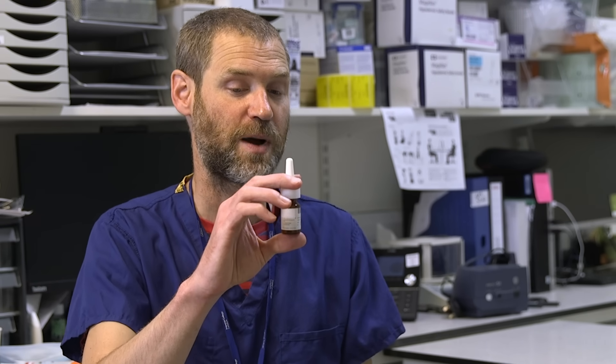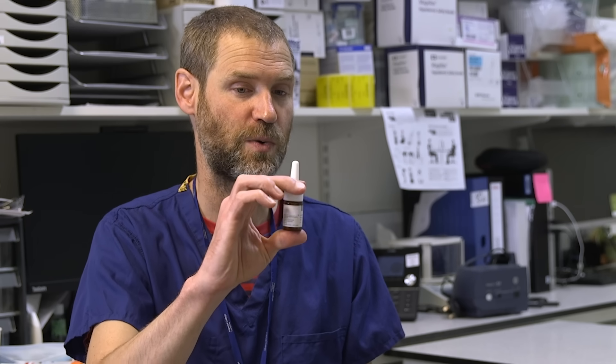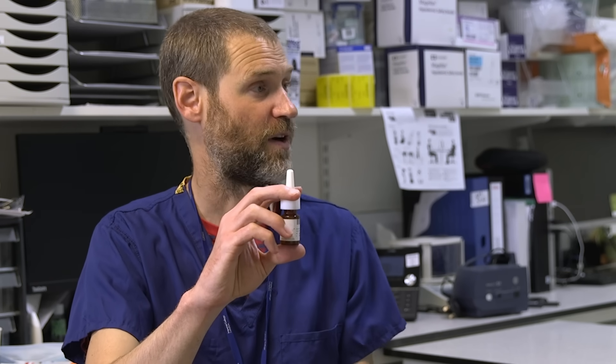When you first get one of these and you're about to use it, take off the top clearly. When you first pick up a prescription, you may need to prime the bottle. That means just pumping it once or twice until it lets out a fine spray of mist. Once you've done that, it's ready to use and you don't need to do that again while you're on the same bottle.